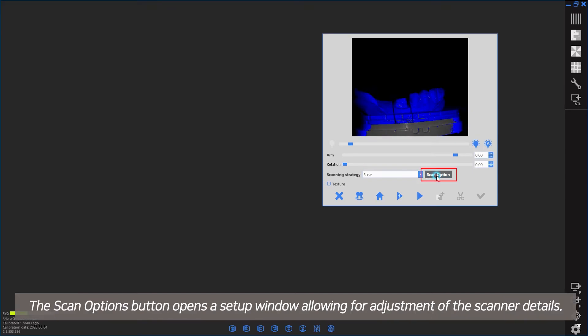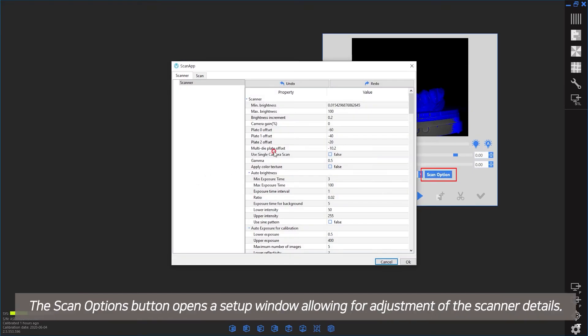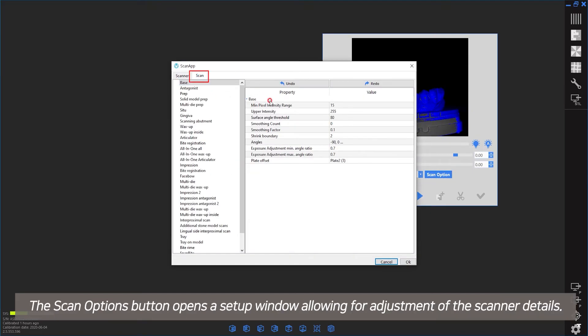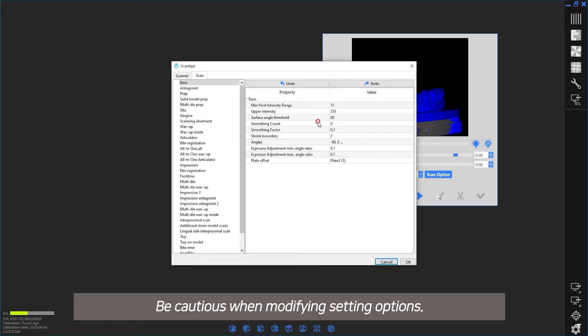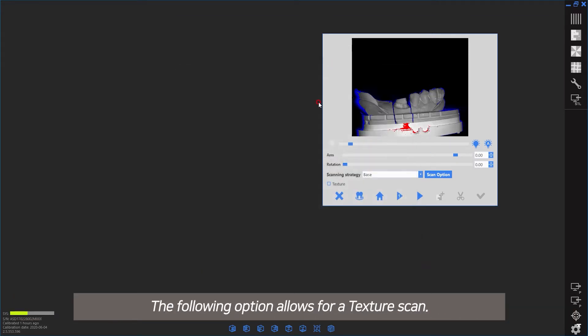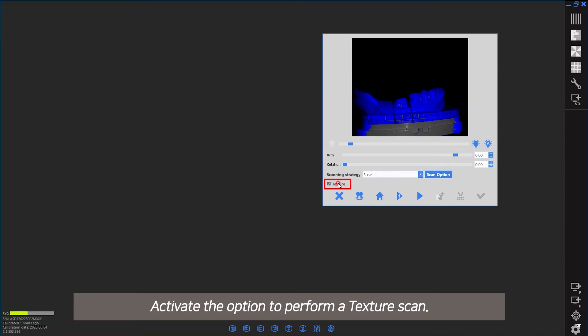The scan options button opens a setup window allowing for adjustment of scanner details. Be cautious when modifying settings. The following option allows for a texture scan. Activate the option to perform a texture scan.